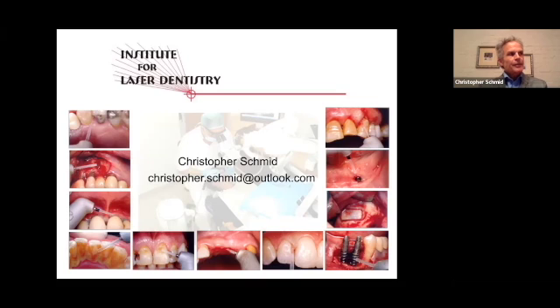Absorption is inversely proportional to depth of penetration. Erbium is higher absorbed in water than CO2, but that means so much more energy is absorbed, the photon turns to thermal very shallow in tissue because it's better absorbed. So within 20 or 30 microns, all of the erbium energy is absorbed in the water, and that's where it stops because it's better absorbed.